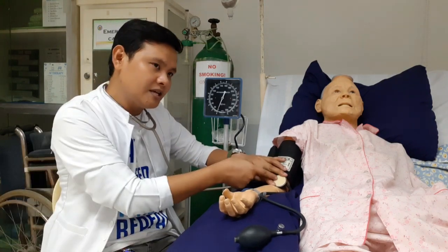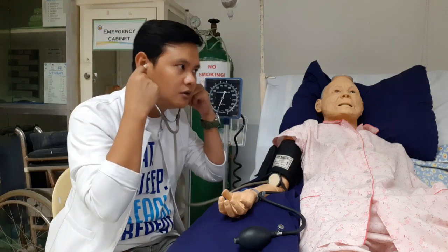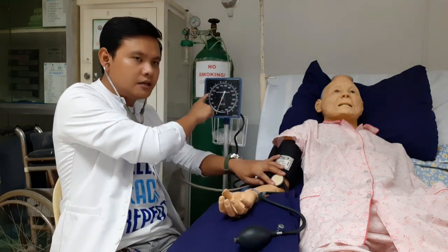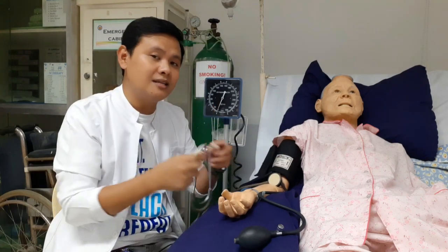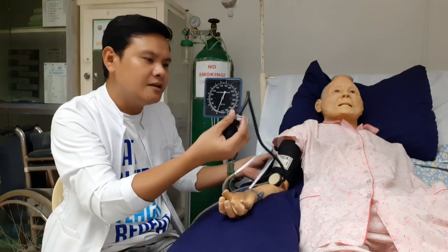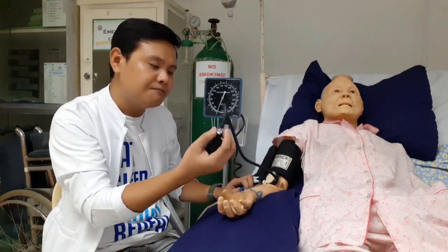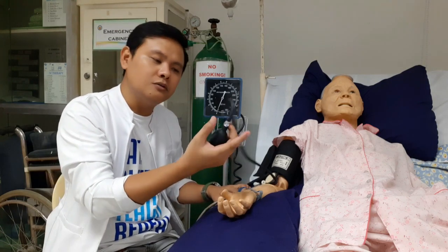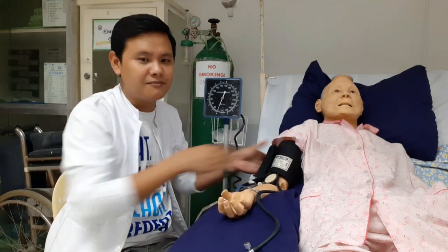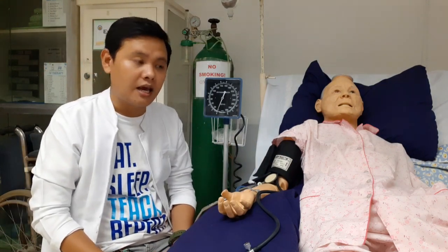Kaya paano auscultating it? Okay? In-auscultate mo, ang pinakamahina na narinig mo ay gawi sa 80. Okay, so the diastolic is 80. So ang BP ng pasyente natin is 130 over 80. Pag nakuha mo na yung diastolic, okay, pwede mo nang i-open ng malaki ang iyong valve. Okay, then i-deflate mo na yung BP cuff. Deflate the cuff rapidly and also completely.